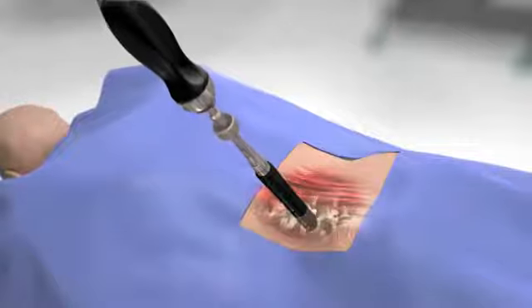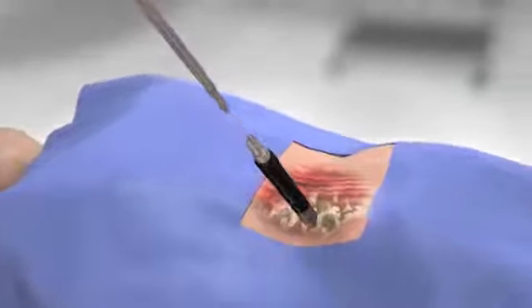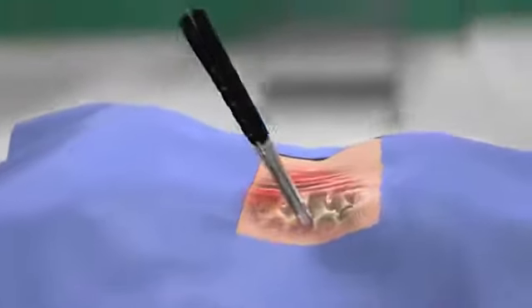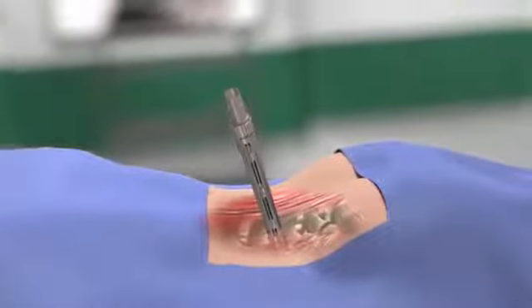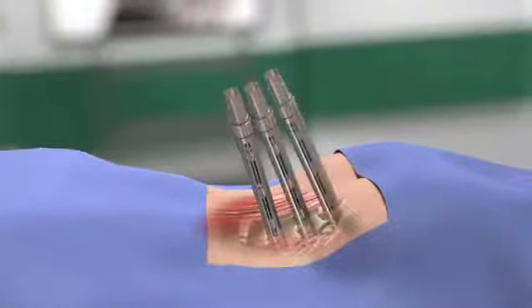When pedicle screw insertion is complete, remove the driver and dilator four, leaving the screw and extension in place. Repeat this process for all levels to be instrumented.